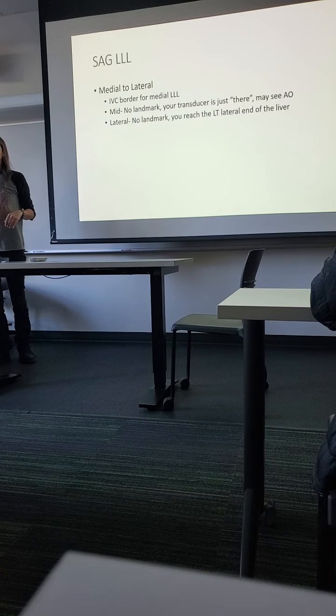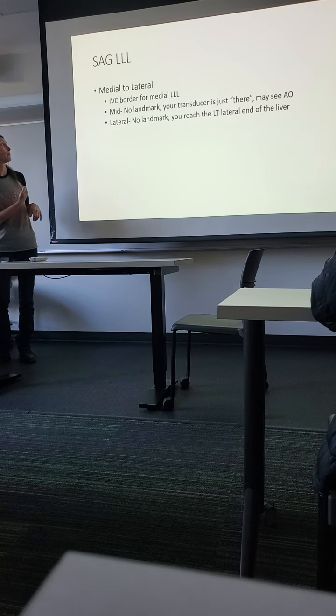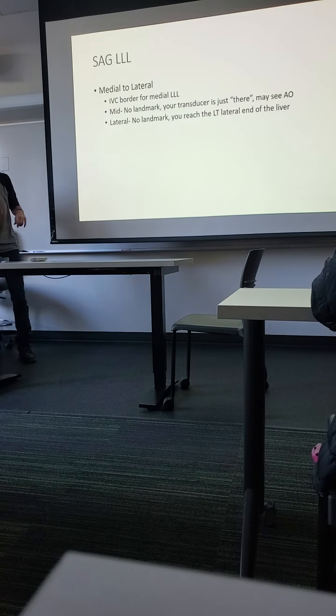So for sagittal, we're going to sweep through that liver, sweeping for pathology, and then we're going to take a medial image with the IVC, a mid image, and a lateral image. And I'll draw this on the board, we're ready to roll here.